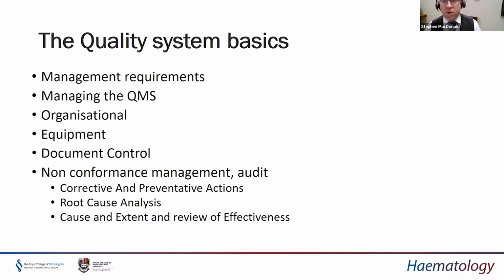And all of these things that are managed are under a very tightly managed document control system, so that if we have standard operating procedures and validation documents and the whole wealth of documentation that is required to support a quality management system, these are controlled in a manner that means it's all very harmonized and standardized. We know we have the information to support any claims that we're making. We know where to find it, and we know that it's valid.